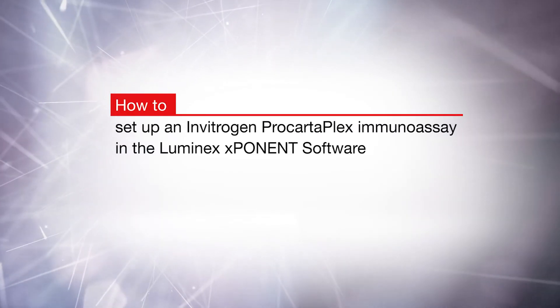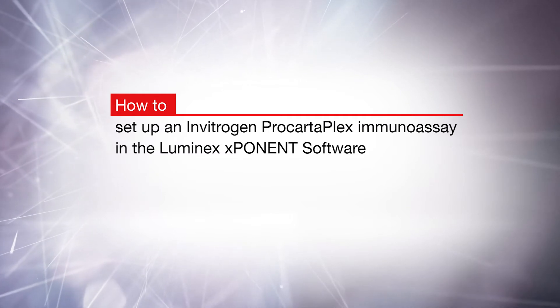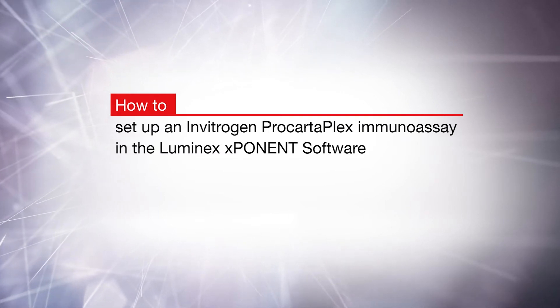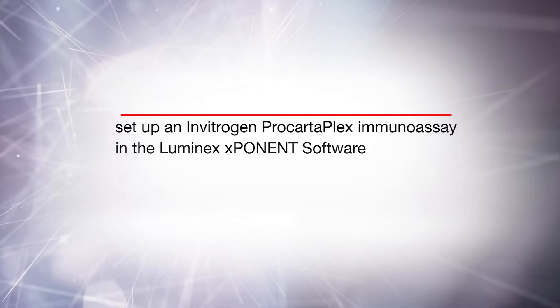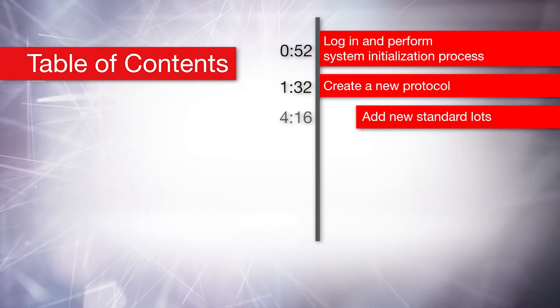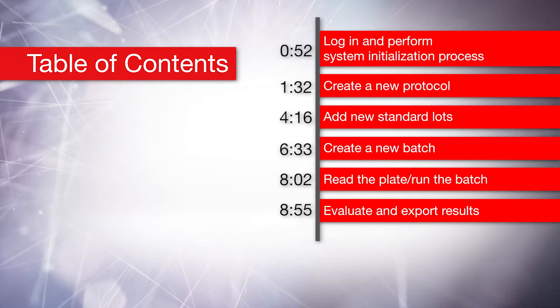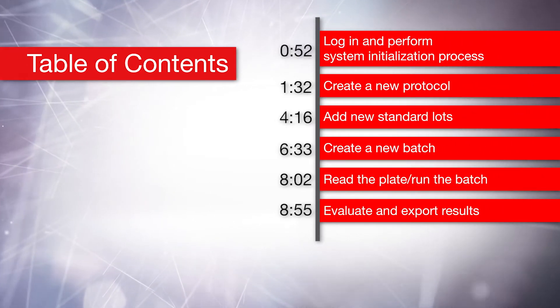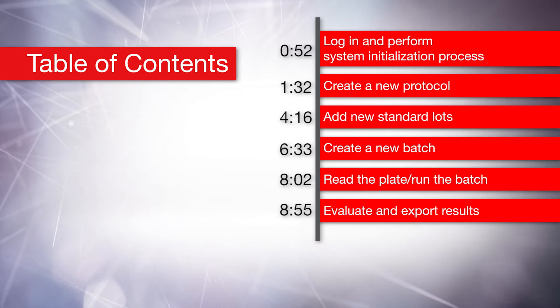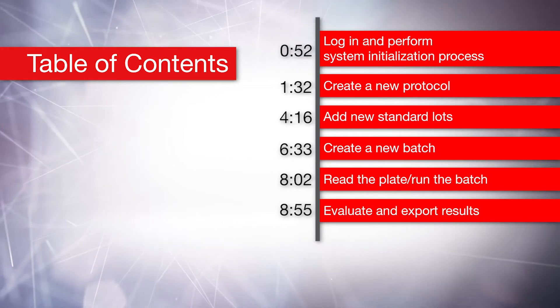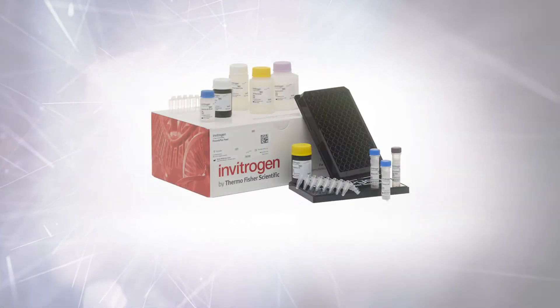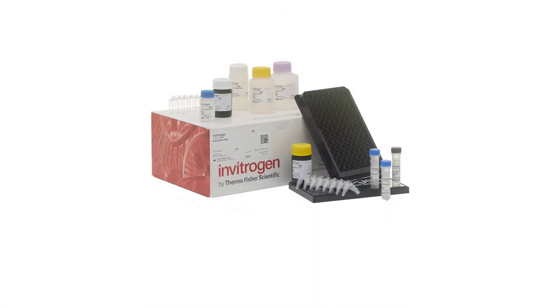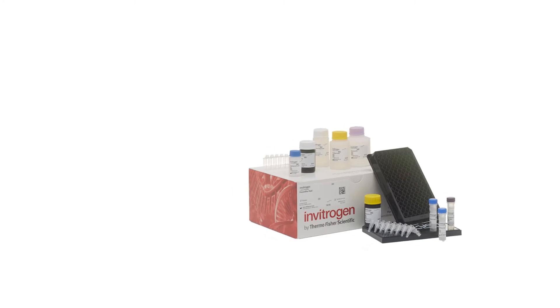In this video, we will demonstrate how to set up an Invitrogen ProCartoPlex immunoassay in the Luminex Exponent software. For the purpose of this video, we will demonstrate with a Human Immune Monitoring 65 Plex panel and will reference the Exponent software for a Luminex 200 instrument.